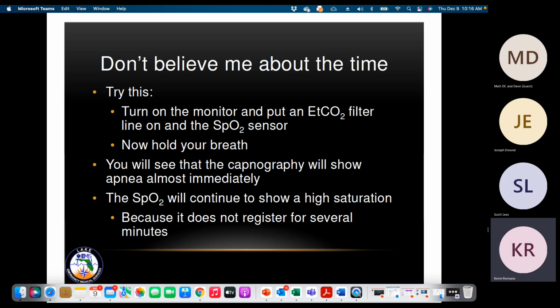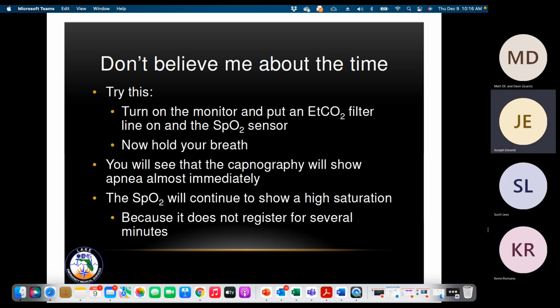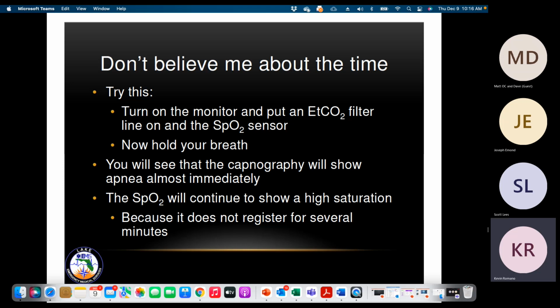So you want to make sure you're paying attention to your patients. End-tidal would have picked that up in 10 seconds. Now, believe me, I'm not saying every BLS discharge put end-tidal CO2 on through nasal cannula. That's not what I'm saying. That would cost companies a fortune. Patients that require it should be on it, though.